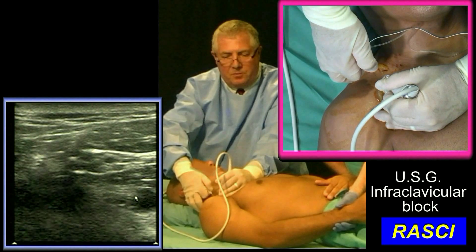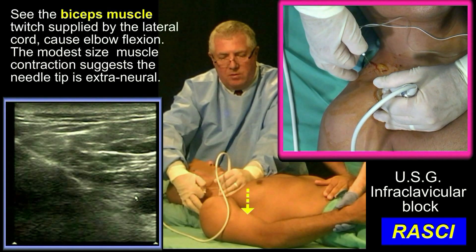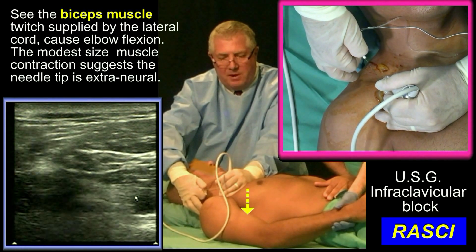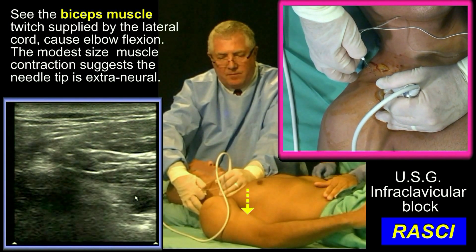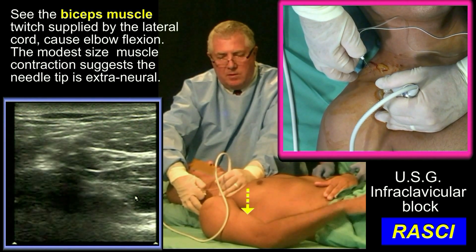I'm now going to come back and find the lateral cord. I'm aiming for 11 o'clock from the artery. And there's my biceps twitch. To remind you: make the first injection of 20 milliliters onto the posterior cord, then inject 5 milliliters at the 6 o'clock position for the medial cord, then lastly inject 15 milliliters onto the lateral cord at the 11 o'clock position.